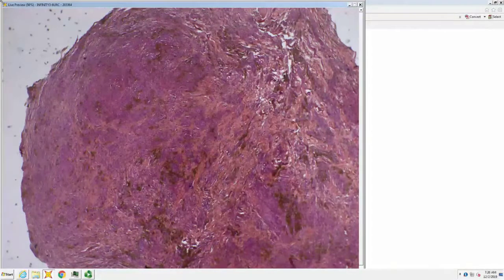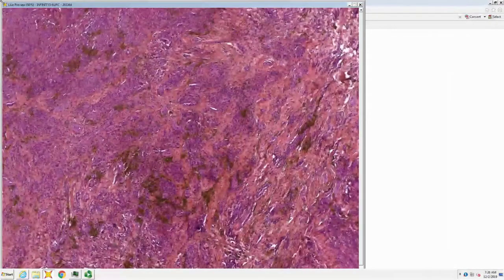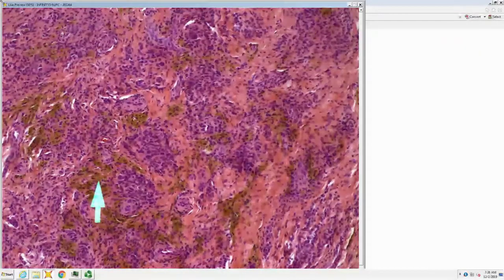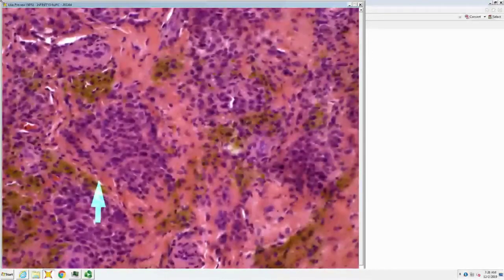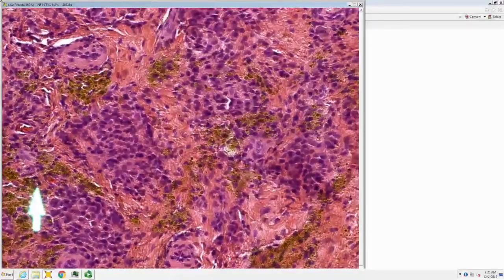All right. So, a large fibrous growth. It looks like there's maybe some hemorrhage, or I don't know if that's hemosiderin. So there's hemosiderin, kind of a golden brown pigment, and you can see if you go higher power and flip down your condenser, you can see how refractile it is, how it twinkles at you.